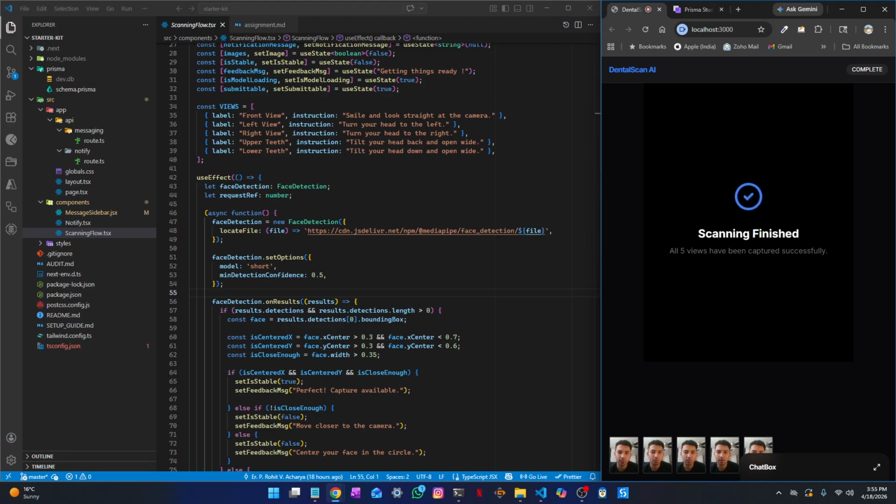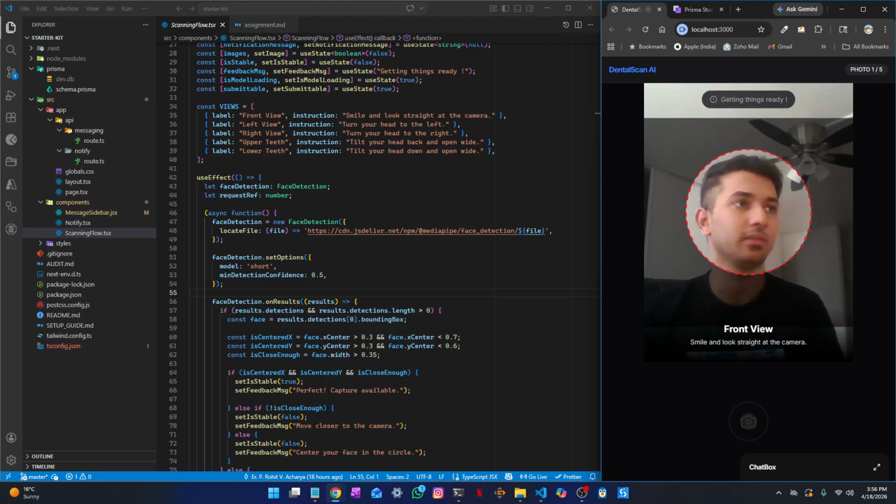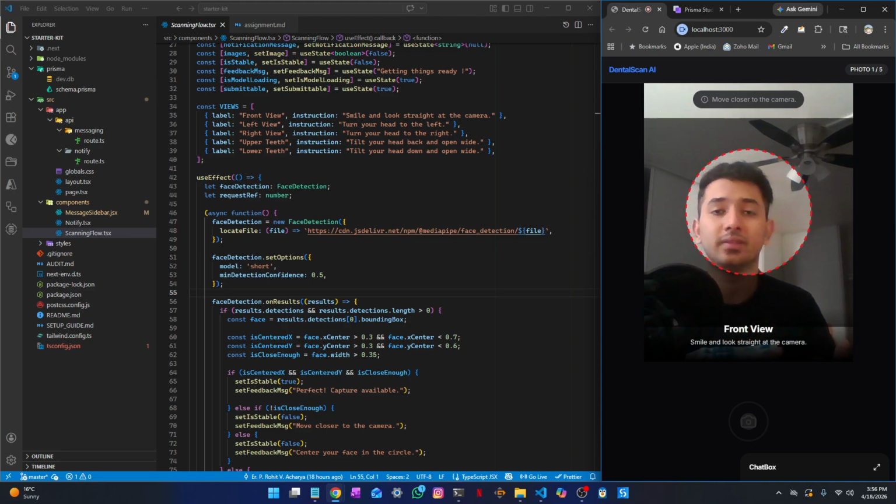So as soon as I click on submit, what exactly happens is it will hit the backend call. As soon as I click on submit, it will hit the backend API, and from there all the images along with the user's data and the scan ID. Basically for the scan ID I have used UUID because it generates a unique ID every time, and to store the user ID I've used the username, as you can see in the code. And apart from that, I have converted all these 5 images into base64 to process the image, and I'm hitting the backend call to store the data.